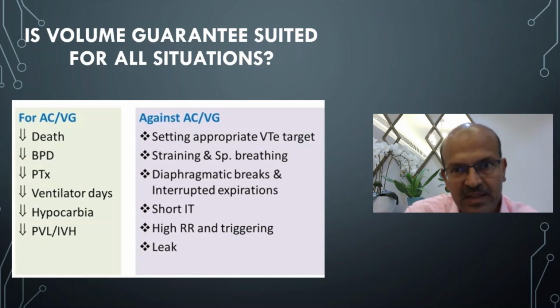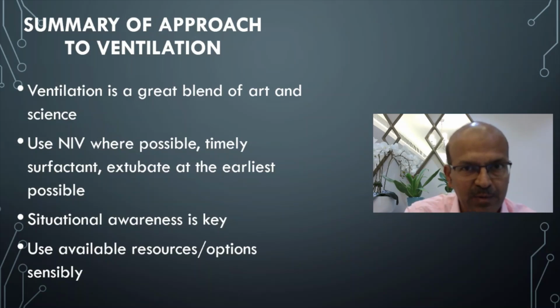So remember that there is a video where Dr. Bancalari discusses this aspect, and most of the aspects that I discussed are similar to what he discusses in that as well. So in general terms, we have to be clear about what we want to achieve, and what mode you use to achieve that is purely up to you.